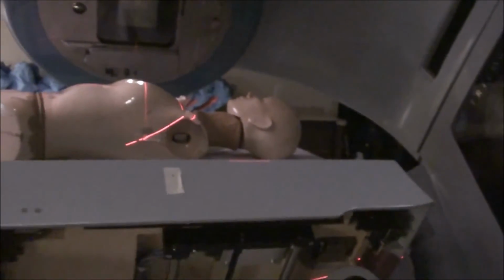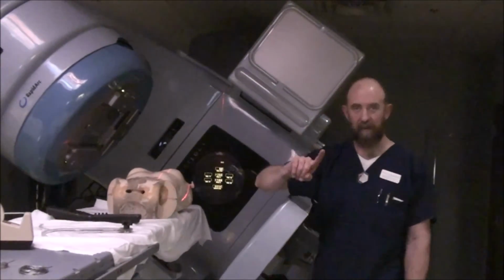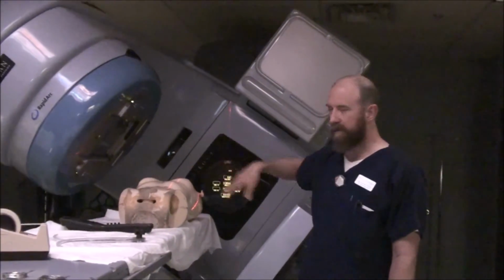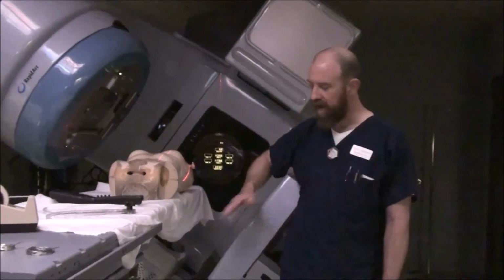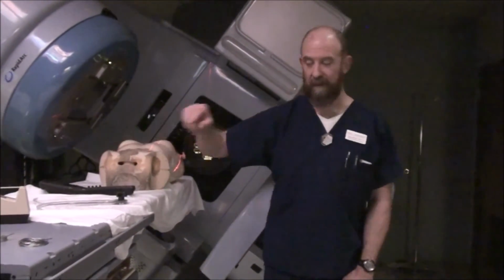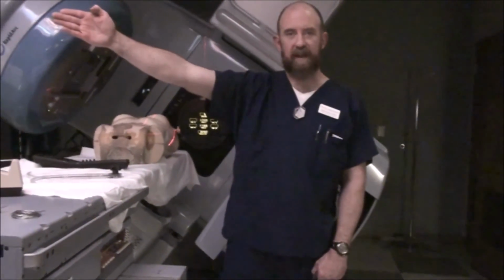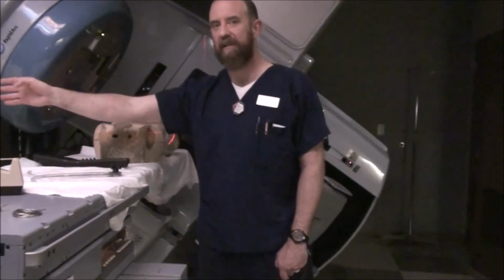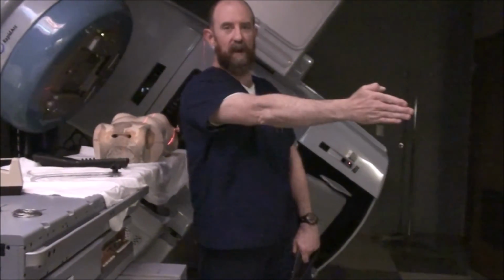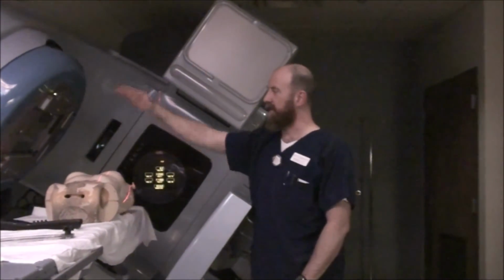So you will do your normal marking and go on with your tangents. It'll just be with a table kick. Remember, do this side, rotate over, don't crash, don't kill, mirror your table. We're 4 degrees off this way. When you go to the lateral, we have to be 4 degrees off in the opposite way. With the head and neck, you have to have the feet to the gantry. With a breast, you have to have the feet away from the gantry. It's flipped over backwards from a head and neck. All you've done is flip the pancake.